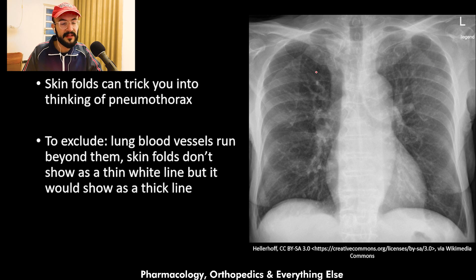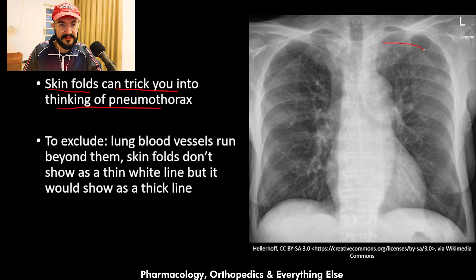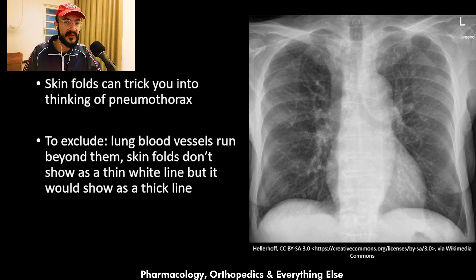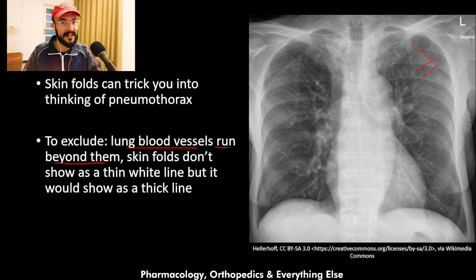An important differential diagnosis for pneumothorax is skin folds. Skin folds can trick you into thinking of a pneumothorax because they resemble a lung edge. You can see skin folds here and here on this x-ray. To exclude pneumothorax, look for lung blood vessels or lung markings — they will run beyond the skin fold. Also, a true lung edge appears as a thin line, whereas a skin fold appears as a thick line.